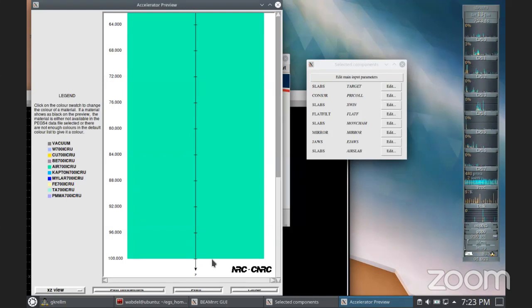If, for example, your PDDs are a bit higher than the measurements, then you would go back and tweak the linear accelerator. You would use, for example, 17.8 MeV rather than 18. If your penumbras are not good, quite bad, then maybe you will adjust the dimensions of the source a little bit. This is what we call optimization, or generating your beam model.